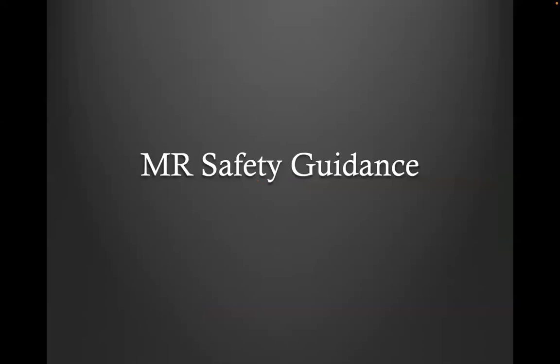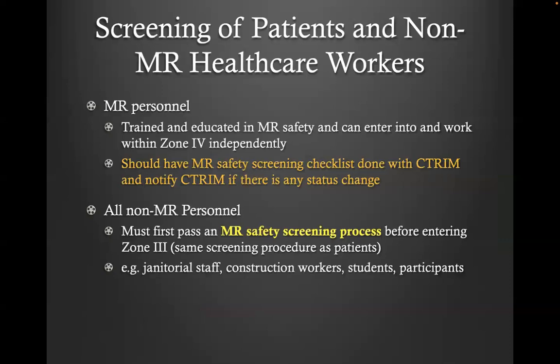Okay, so here is the MRI safety guidance. One is for MRI healthcare workers. After training, you are considered MRI personnel. Only personnel trained and educated in MRI safety can enter into and work within Zone 4 independently. You assume the responsibility for your own safety. And you should obtain an MRI screening checklist with us, especially if you have had any surgeries or any implants in you. We can screen you and make sure that you are safe to enter the MRI.